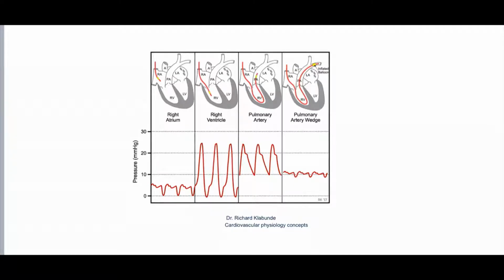The dicrotic notch in the tracing. It will, okay, good. It will represent the closure of the valve. I think so. That's very good.